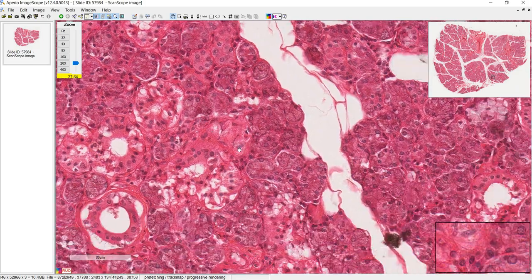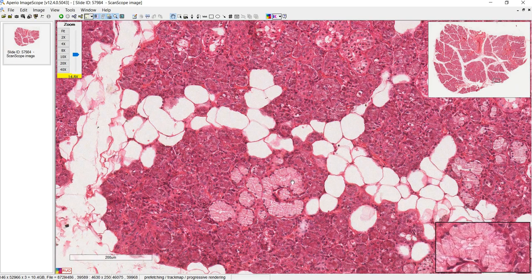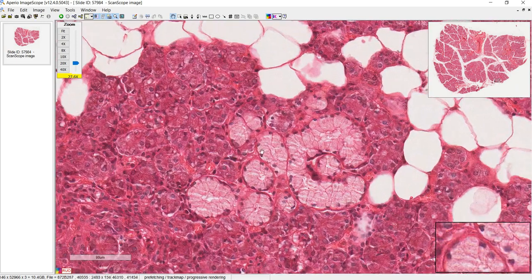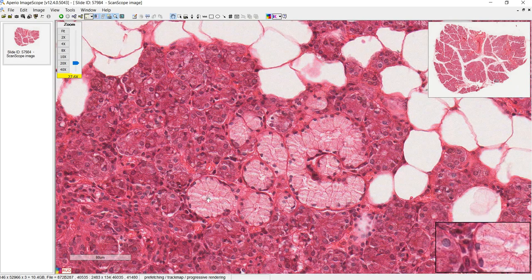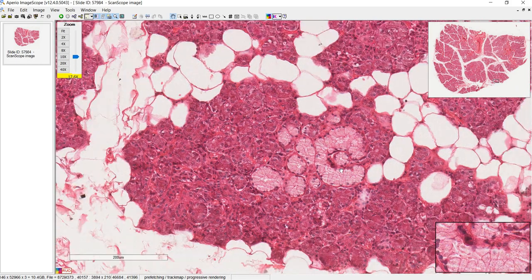See a lot of serous glands here. The mucus glands will tend to come in patches. So here's a patch of mucus glands here, and if you see this, you know you're definitely not in the parotid gland. You see how it's kind of a little more whitish and more bubbly. So that's a mucus gland.